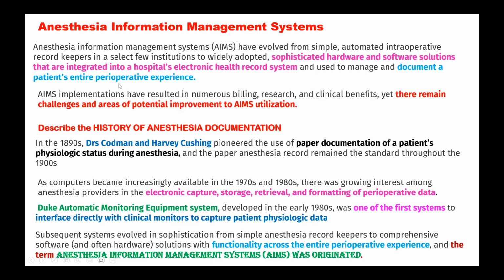And that is what I told you, there are three components. One is all the details about the patient. Second is how the management was done and what are all the scopes for improvement. And the system is the usage of software and hardware.